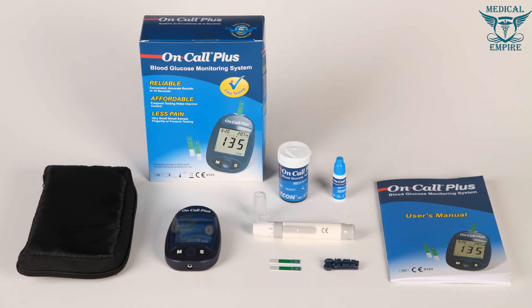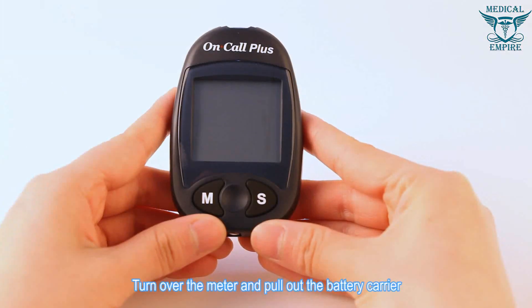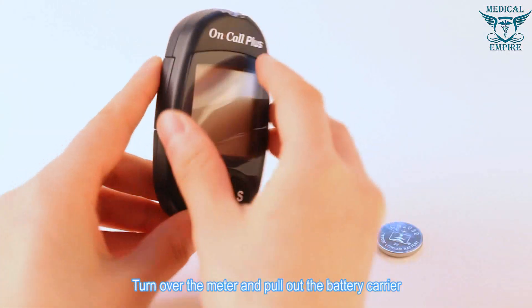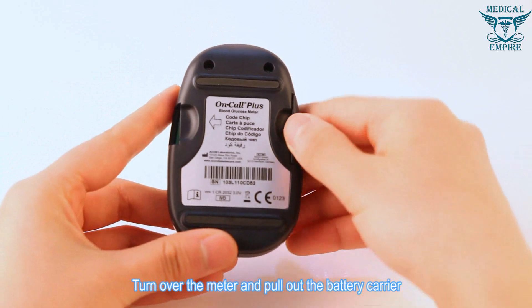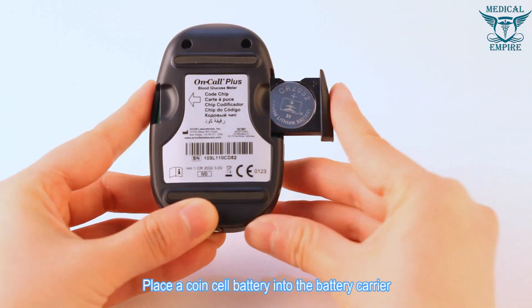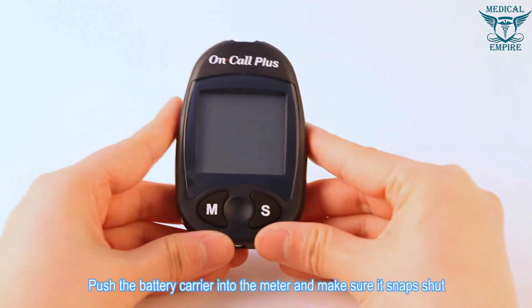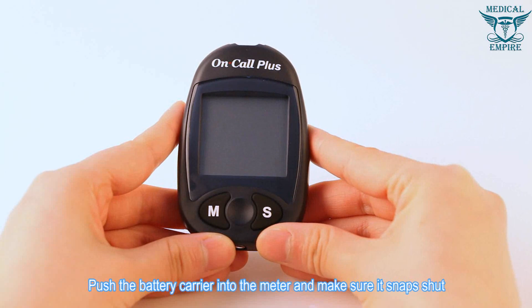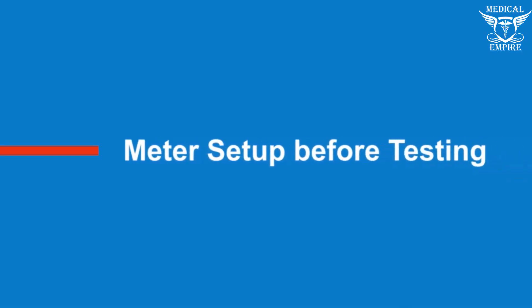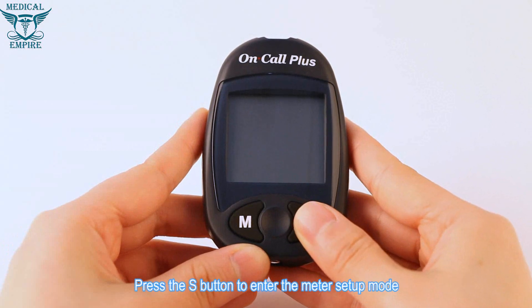Installing the battery: turn over the meter and pull out the battery carrier. Place a coin cell battery into the battery carrier, making sure it's positioned with the plus side facing up. Push the battery carrier into the meter and make sure it snaps shut.